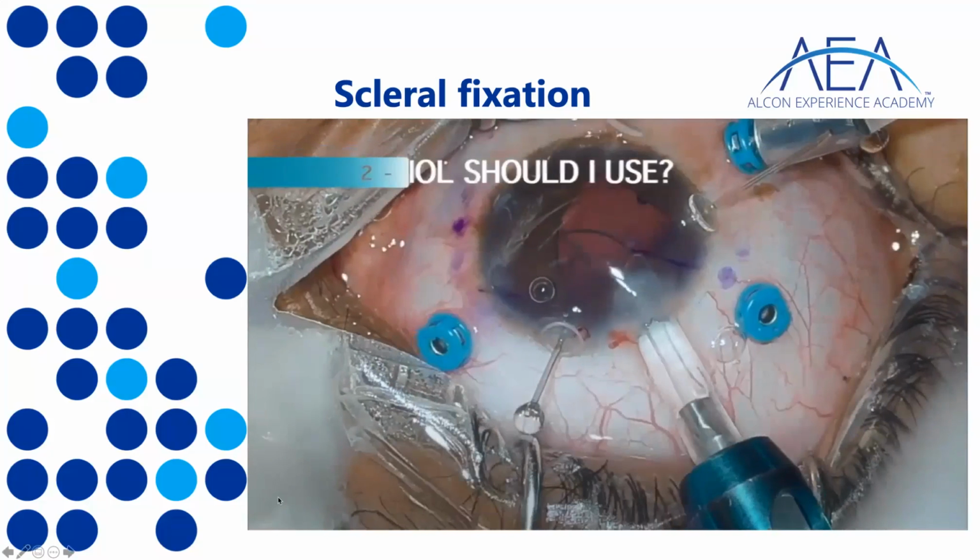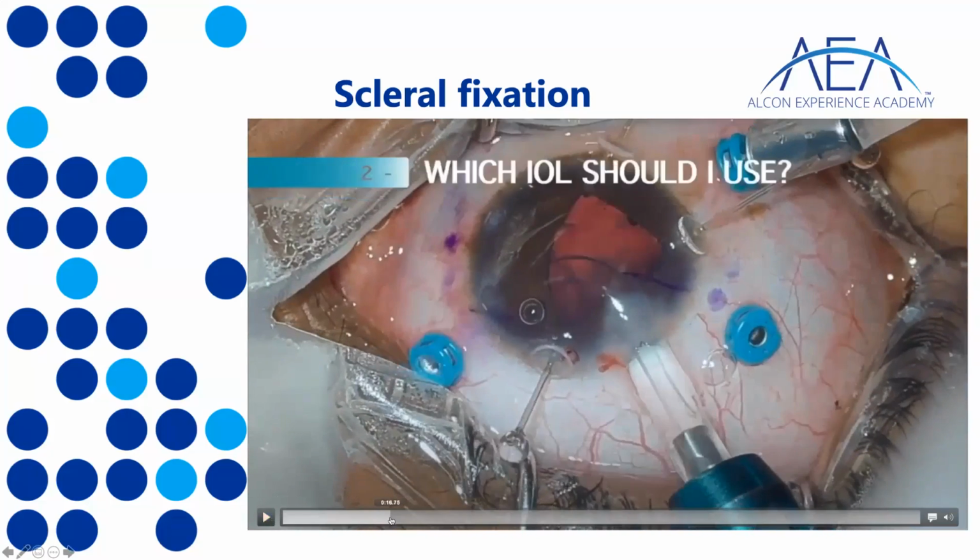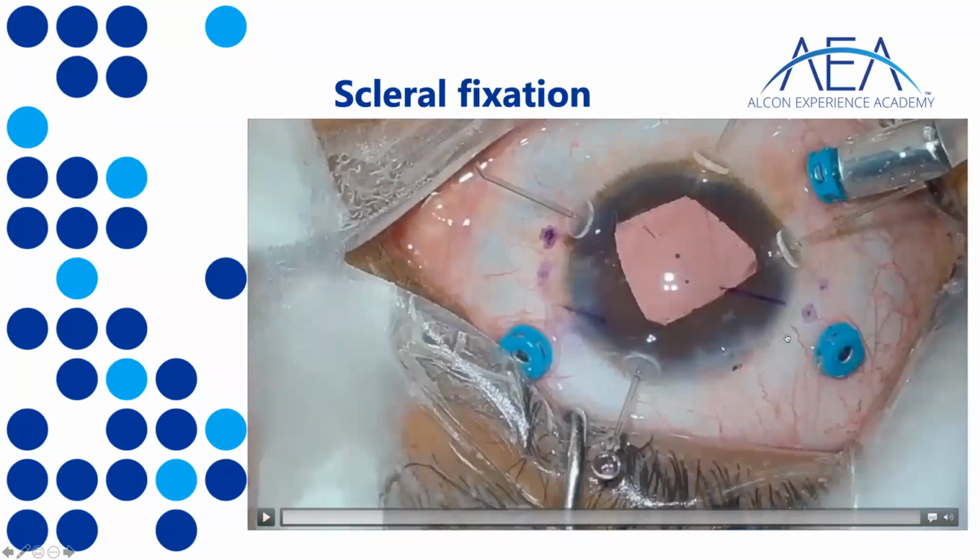You can mark both the cornea and the conjunctiva. It's about 2 millimeters, and then 2 millimeters apart. So those are 180 degrees apart, and this number 1 and this number 2 are about 2 millimeters anterior and posterior compared to the mark. And number 1 and number 2 are exactly where the sclera will be punctured to let the haptic go through.